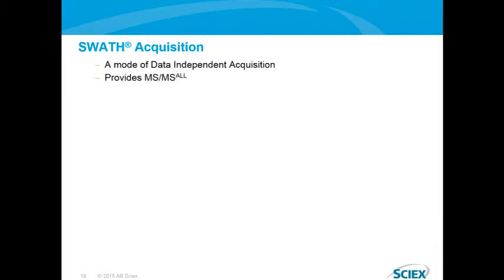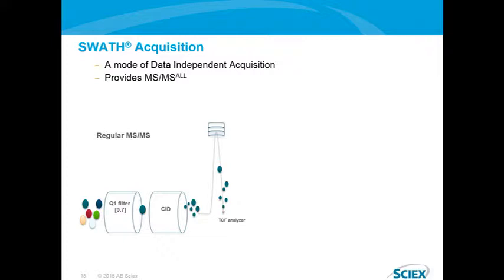We employed a novel non-targeted analytical technique with the LC QTOF, providing highly selective MS-MS analysis of all analytes. Our method used the SWATH acquisition.